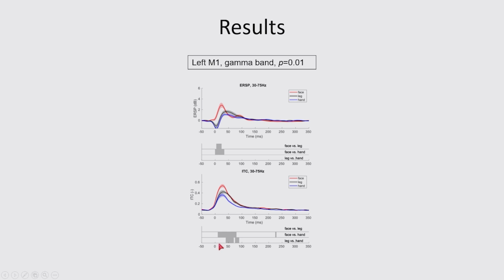So to summarize, even though we've been using TMS-EEG responses mainly on the hand area, across the motor homunculus the responses do differ by looking at almost any measure. In amplitude, there might be different peaks. They differ in cortical excitability as well as in the frequency bands.